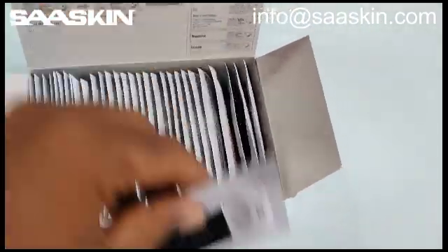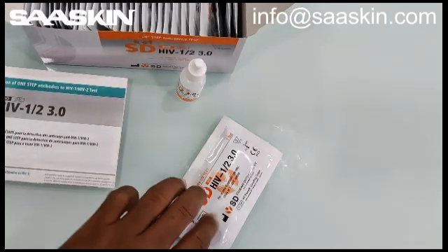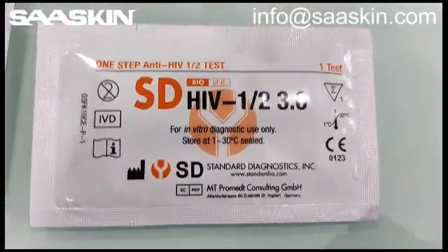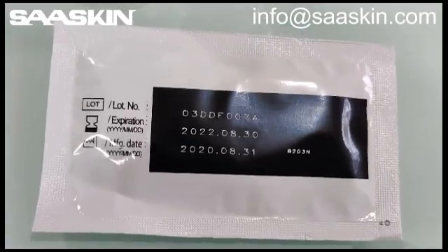Let me show you one test cassette. This is the test cassette. This is what the single test cassette looks like. And here is the other side of the test cassette which contains the manufacturing and expiry date.